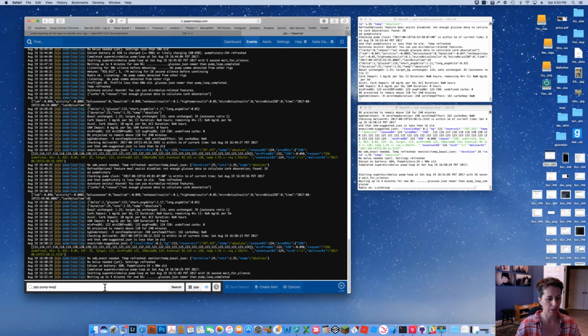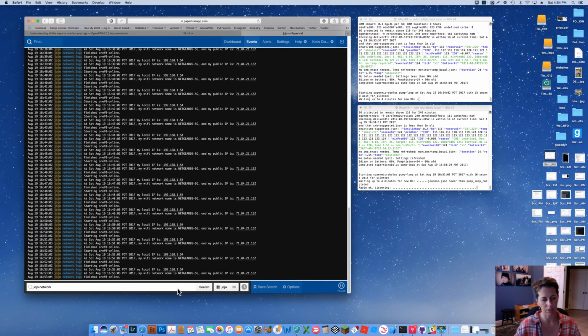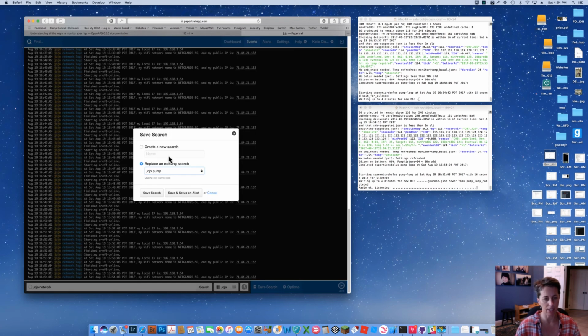And now I'm going to save one for JoJo network. Let's search it. Fantastic. Let's save it. Let's call it JoJo network. Save the search.